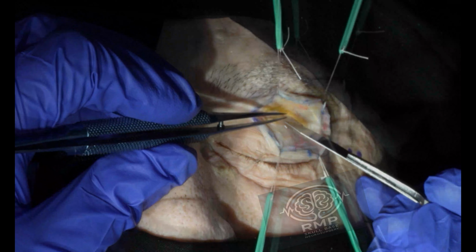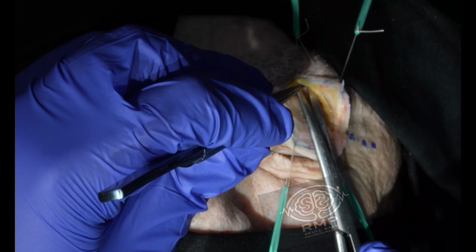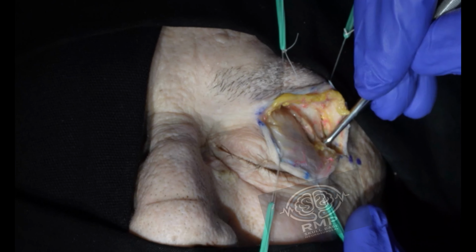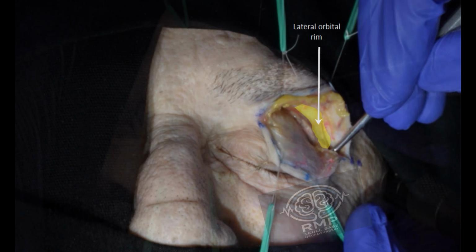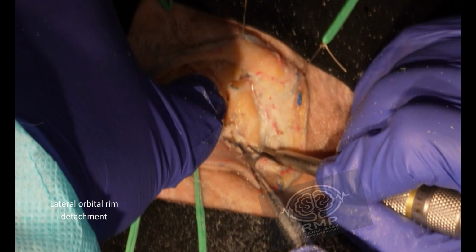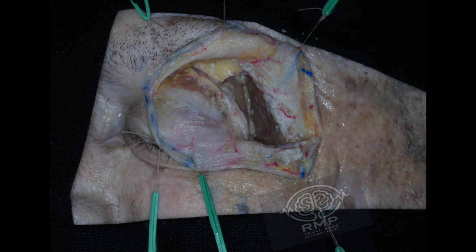Then submuscular dissection is carried down to find the orbital rim. Temporalis muscle is disinserted minimally from the orbital rim. Here we prefer to perform a 2x2 lateral orbitotomy to increase the maneuverability corridor and minimize orbital retraction. In this view, we can appreciate the orbital content and the temporalis muscle.